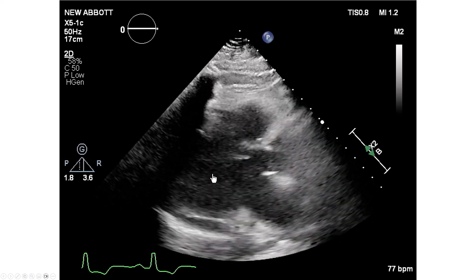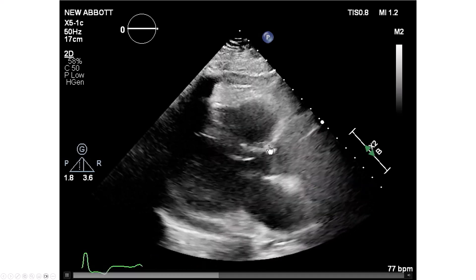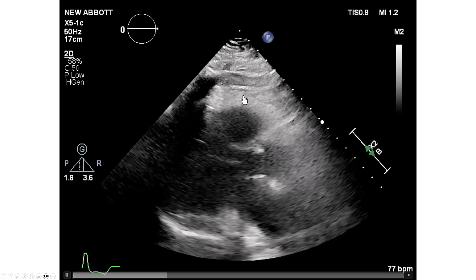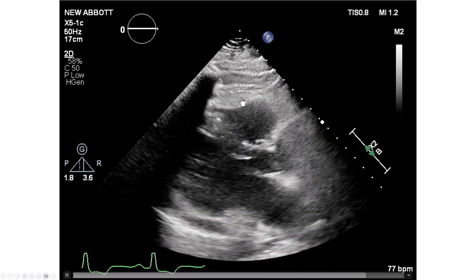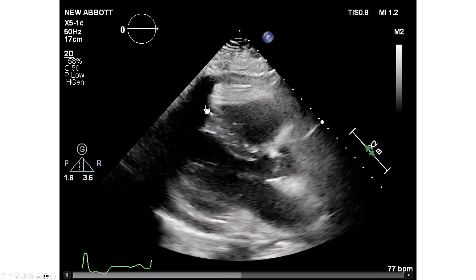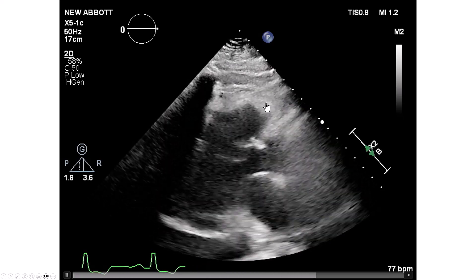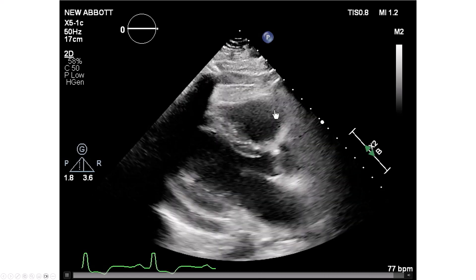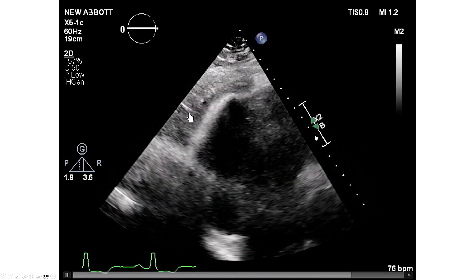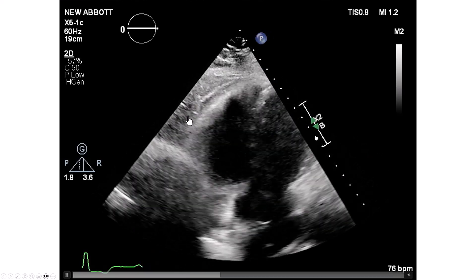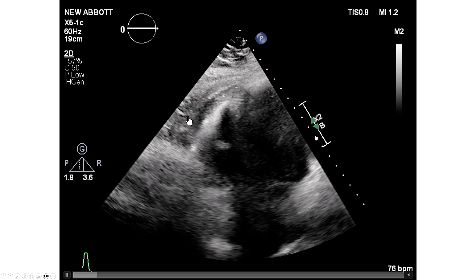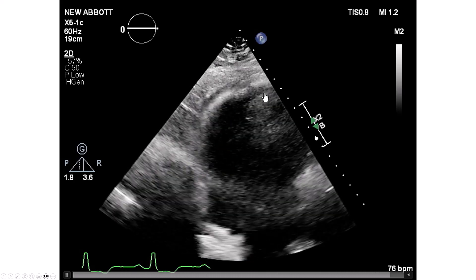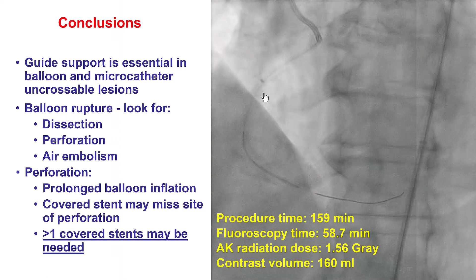We did an echocardiogram in the procedure room after the procedure was done. There is a very small pericardial effusion, with some staining along the wall of the right ventricle, potentially from contrast going there — again, a very small effusion. The patient did well and did not require any additional treatment for the right coronary artery.